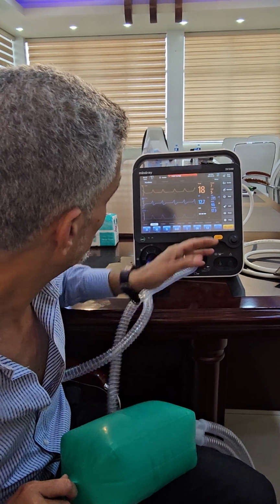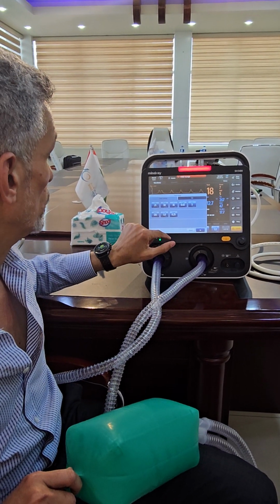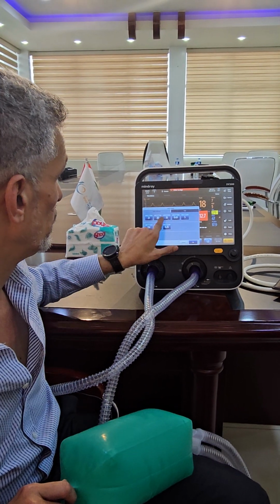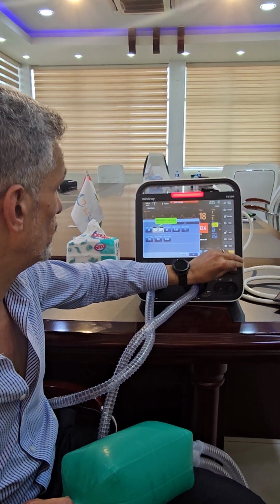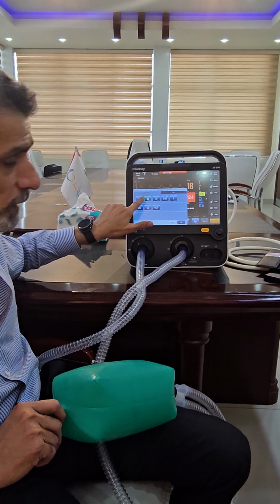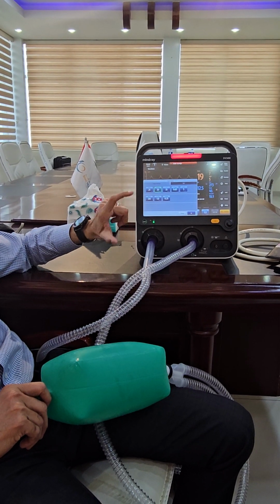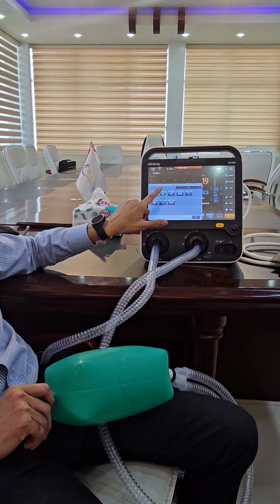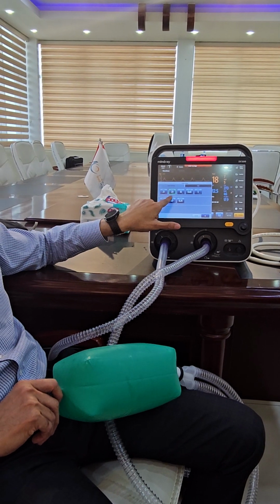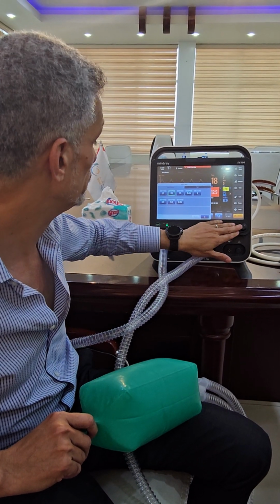No, this is the delta. Anyway, this is adult, I don't like it. So change it, maybe we can put it less. Only the change. Now, whenever you see a triangle, it's the change. It's the delta. It's the difference between a pressure, between a volume, between a flow. Whenever you see it, it's a change. And I will tell you later what that is. Because this is not PIP, this is the delta PIP.